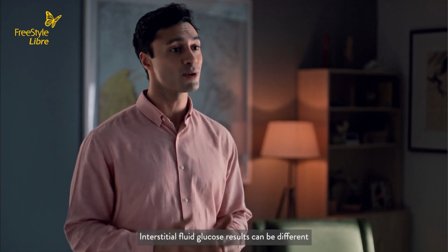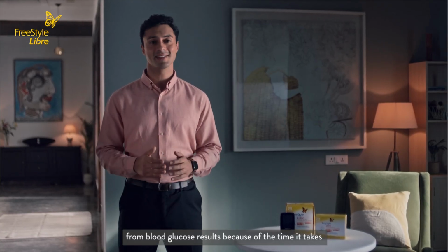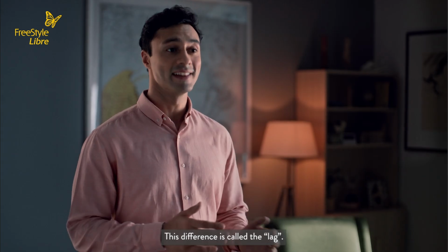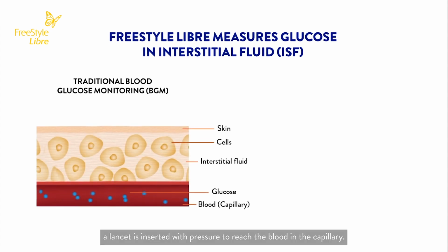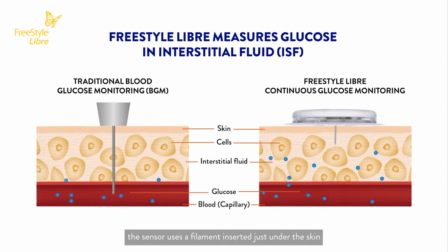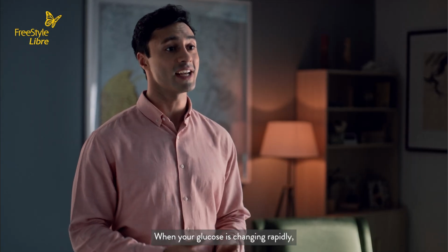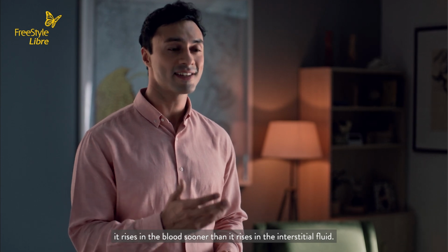Interstitial fluid glucose results can be different from blood glucose results because of the time it takes for the glucose to move into the interstitial fluid from the capillaries. This difference is called the lag. With blood glucose monitoring, a lancet is inserted with pressure to reach the blood in the capillary. With continuous glucose monitoring, the sensor uses a filament inserted just under the skin where it floats in the interstitial fluid. When your glucose is changing rapidly, it rises in the blood sooner than it rises in the interstitial fluid.